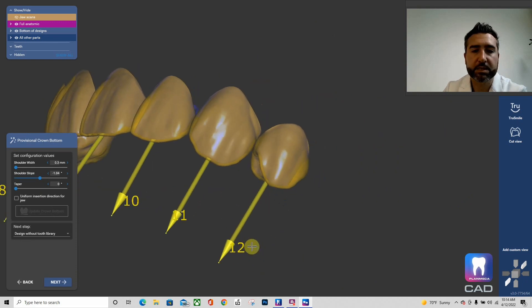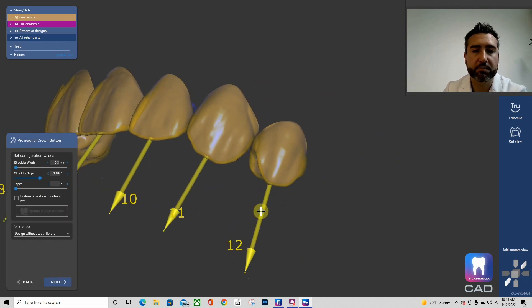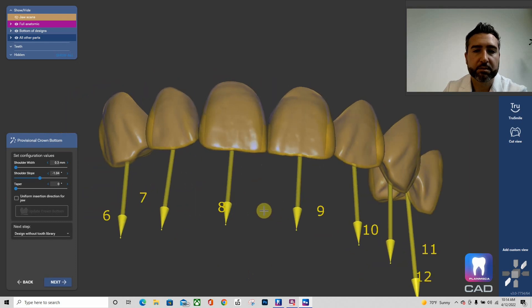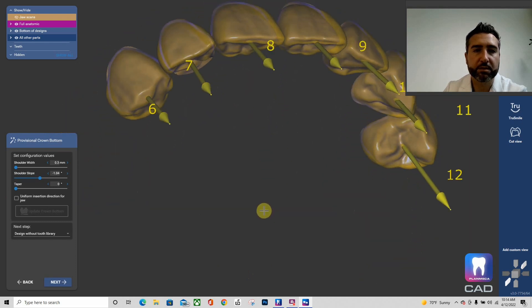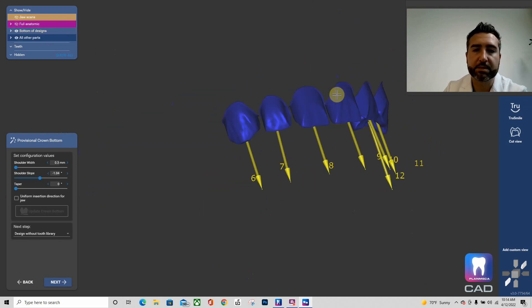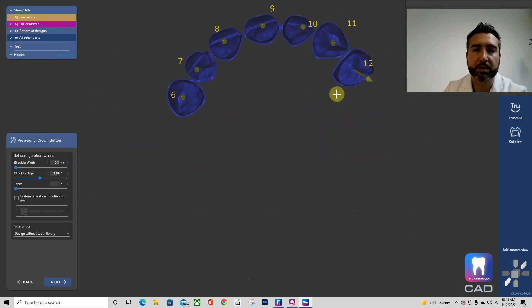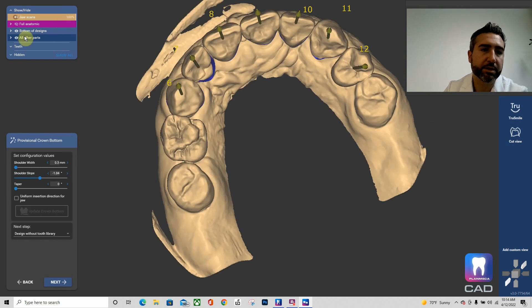Okay, like this is definitely not on the long axis with the tooth. That's looking pretty conservative. The way that you could tell is you turn off your anatomic and look at your virtual preps. Looking pretty good. I think we're all set, so I'm going to go ahead and hit next.